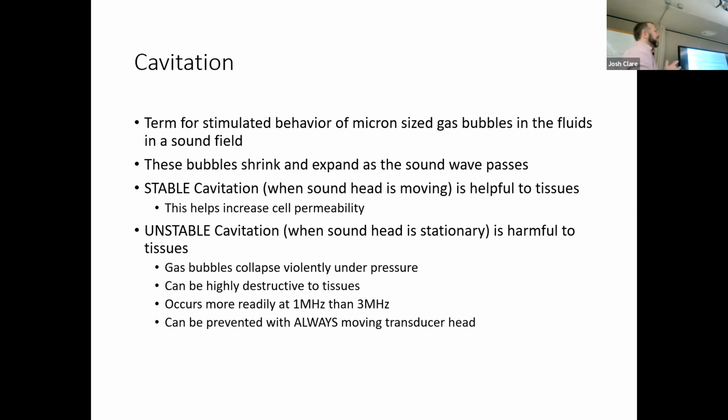So we always keep the sound head moving. As long as we're keeping the sound head moving, our patient is safe. We are fine. The times we're going to have a problem is when we're applying the ultrasound, we're moving it around, and then we have to take our attention to the dials or the machine to adjust a setting or to press the start button. So if you can't pat your head and rub your belly at the same time, you're probably going to have a little bit of trouble with that. So it's going to just take practice. I know we can all get it.